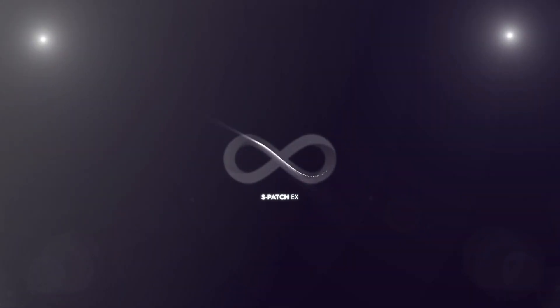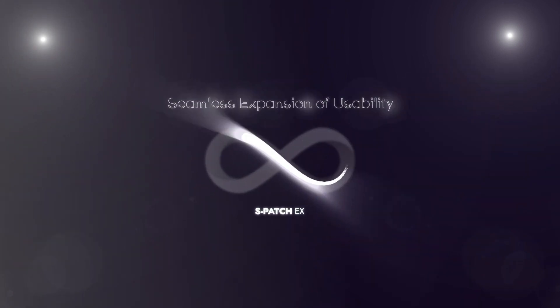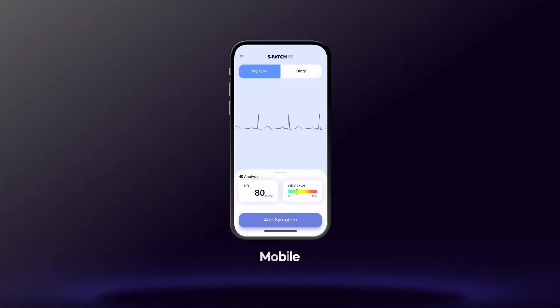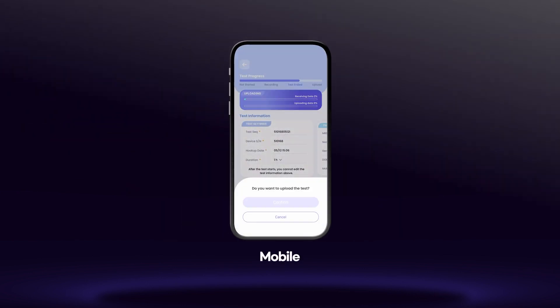Aspatch EX expands the usability of the solution by connecting to various mobile devices. Based on the device type, monitor your real-time electrocardiogram and upload your test data.